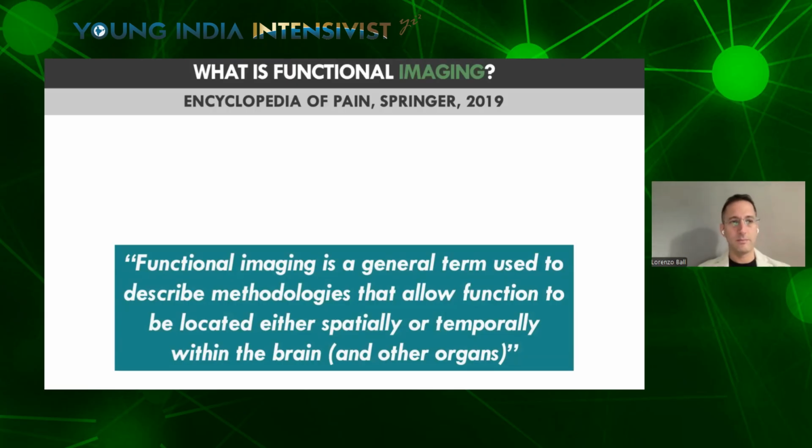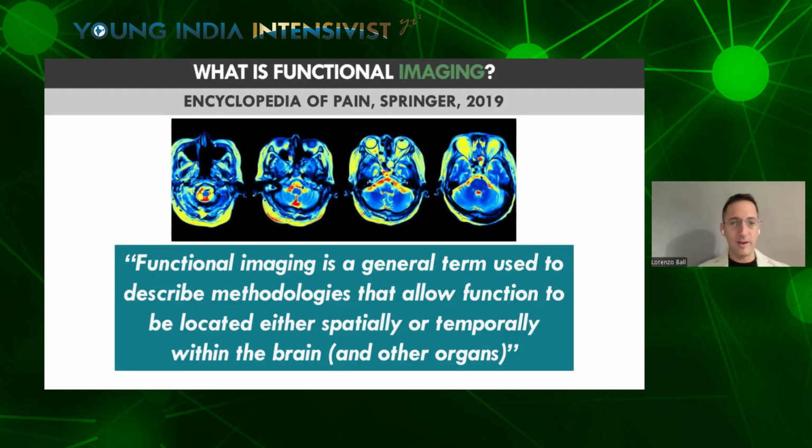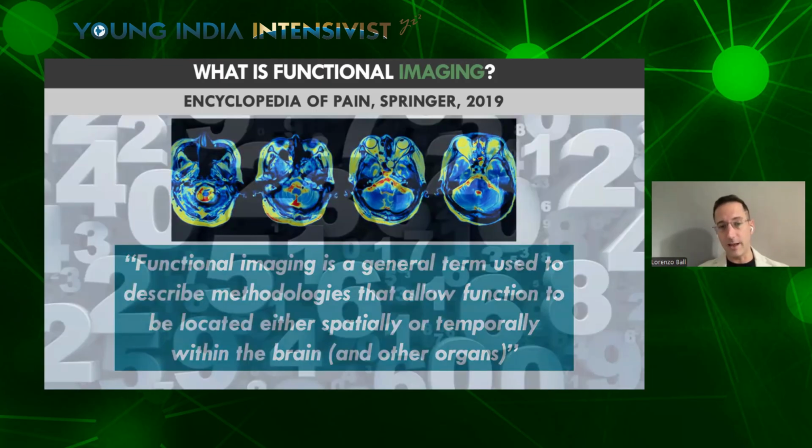It's a naming that I brought, or maybe have stolen, from neurology, actually, because functional imaging is a term used to describe the methodologies that allow the function within the brain to be localized spatially or temporally during the examination. So we are thinking about advanced MRI or studies of cerebral perfusion, but we actually do the same also in the lungs and in our daily practice.